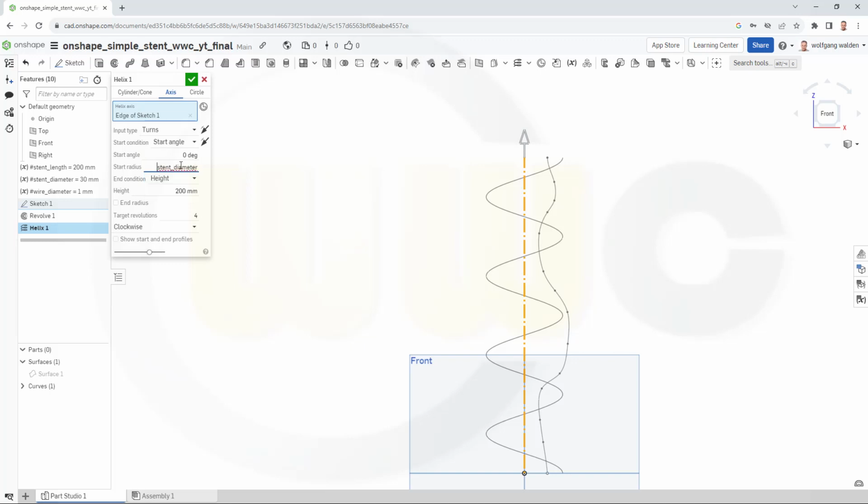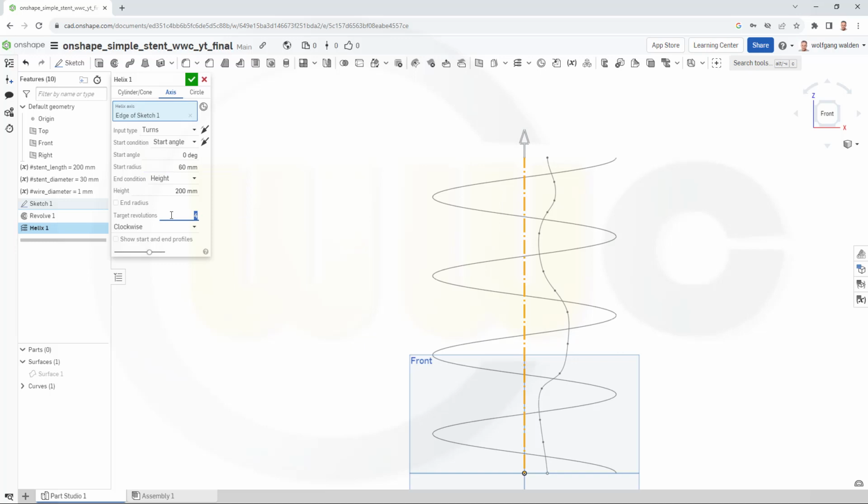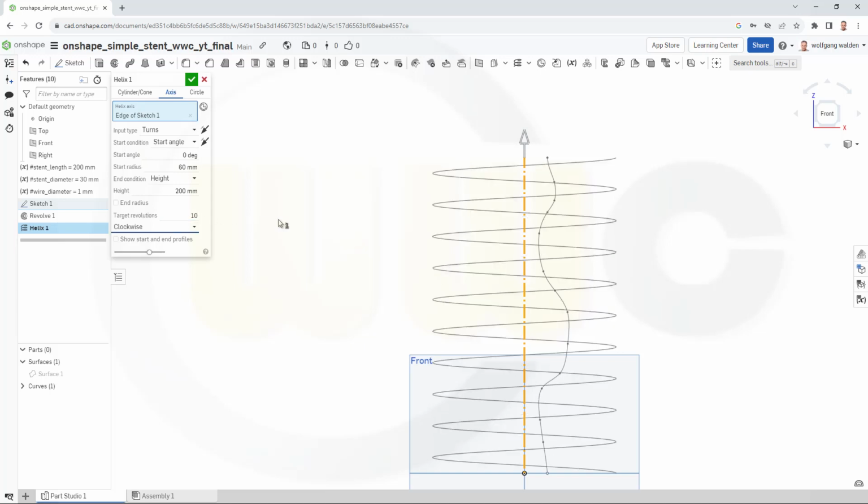Don't forget that hashtag. And I want to use a greater value, so I want to go for a bigger value, so go for 2 times the stent diameter, just in case, to make sure it works. Okay, and the turns, I want to go for 10 revolutions. Yeah, that's okay, and confirm.